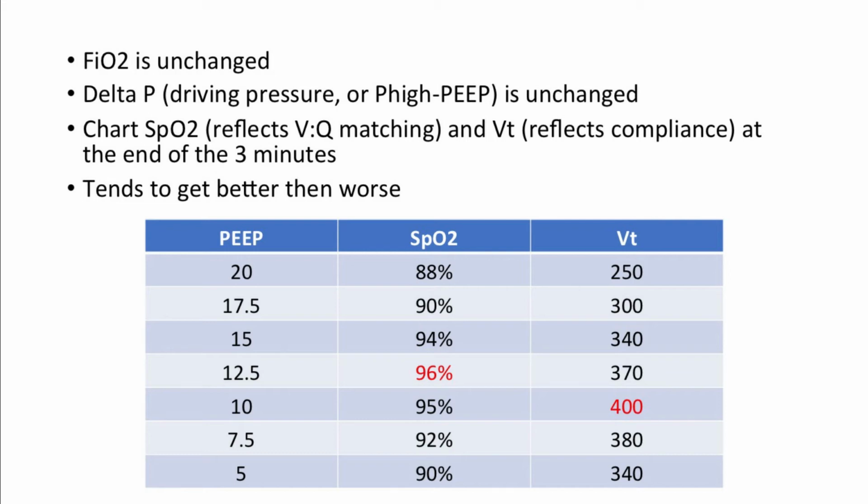So it's quite time consuming, as you can see, it's quite arduous. Have I explained it clearly? Do people understand why you do that? So that's a really scientific approach to what is the best PEEP. Whether it helps or not is not that clear, but it's clear if you do really high pressures, it's bad for you.